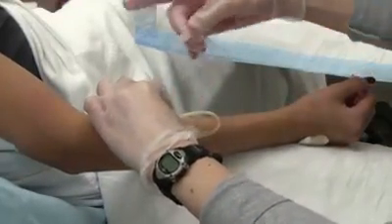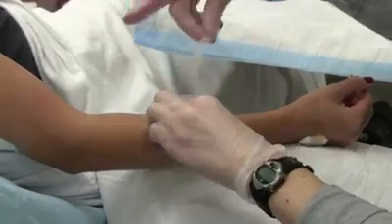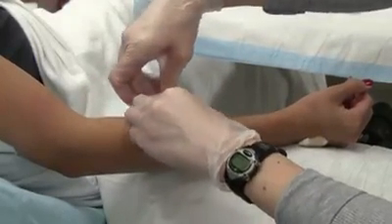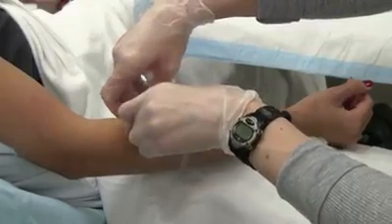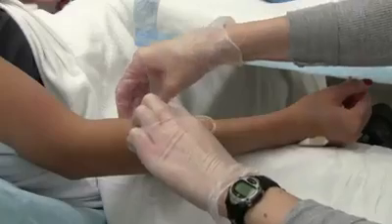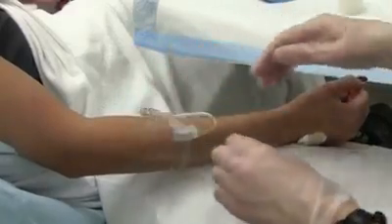Label your venipuncture site with the date, time of insertion, type and gauge of catheter used, and the nurse's initials. Discard tourniquet.